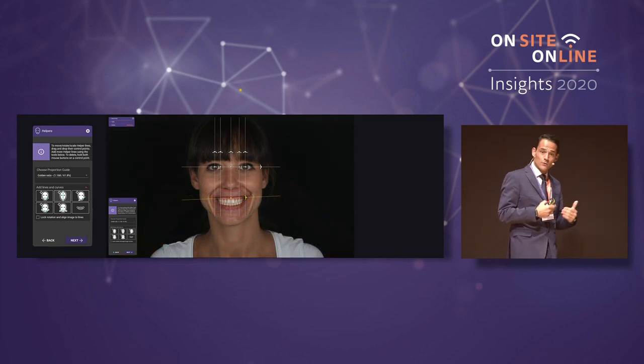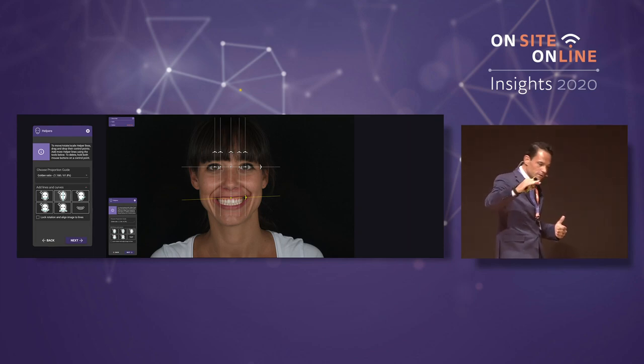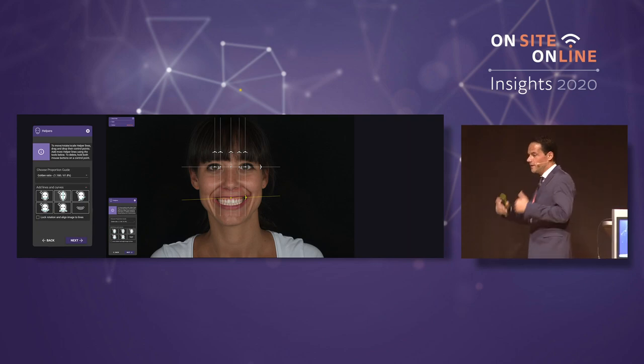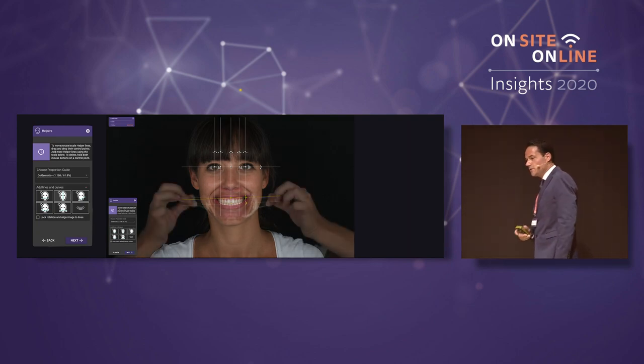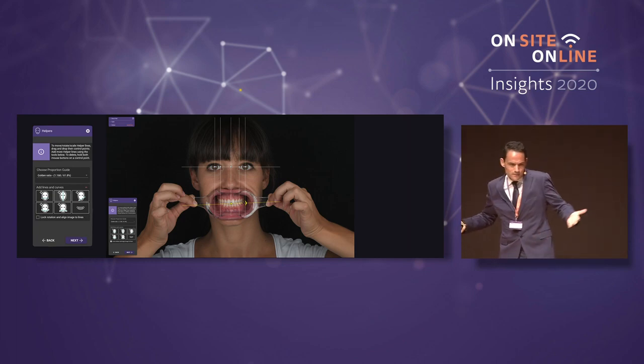If you are going to make a crown lengthening, it is very useful to use these positive or negative curves to evaluate the position of the necks of the gingival area of these teeth. You are going to make a crown lengthening. Sorry about my English, it's terrible, but I will try to speak.